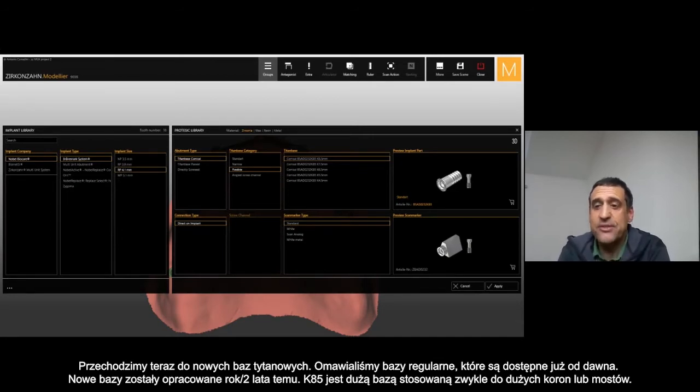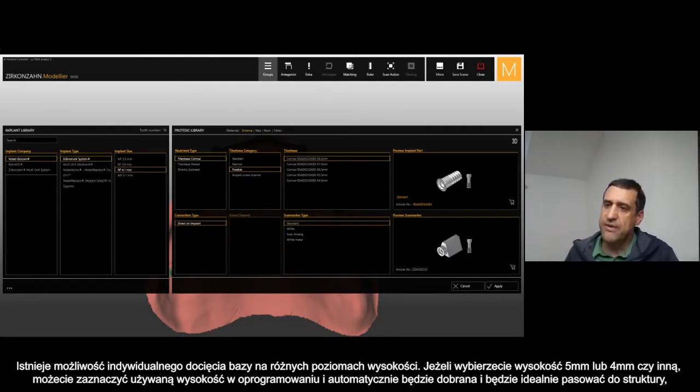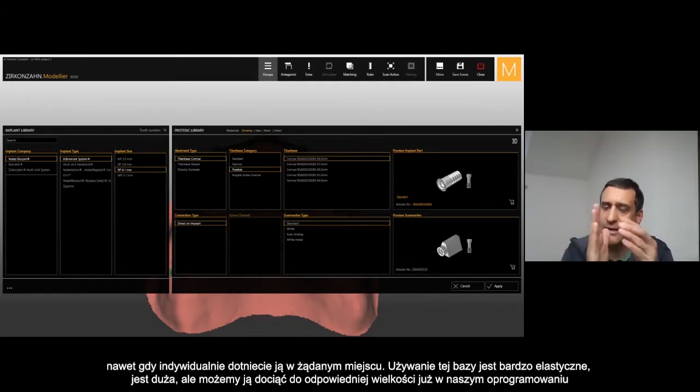Now we come to the new T-bases. The K85 is the large T-base that you can use when you have large crowns or large bridges, just to be safe. You can see that you can cut it at different levels. If you choose here height — for example five by four or whatever — you can select it and automatically it will fit when you cut the T-base at that level.